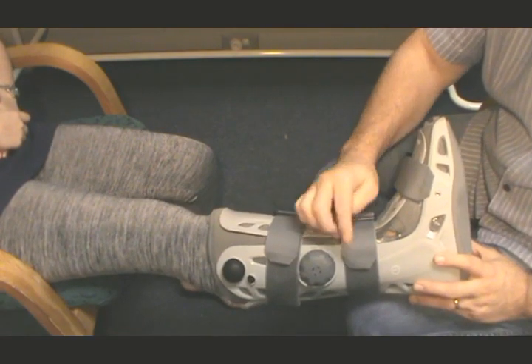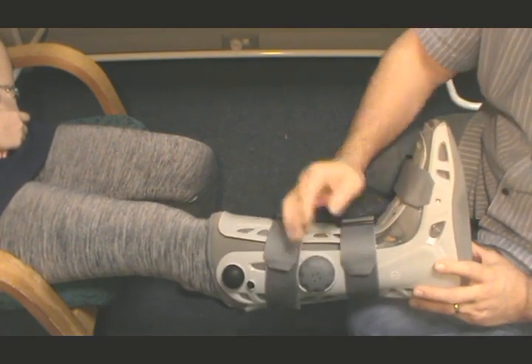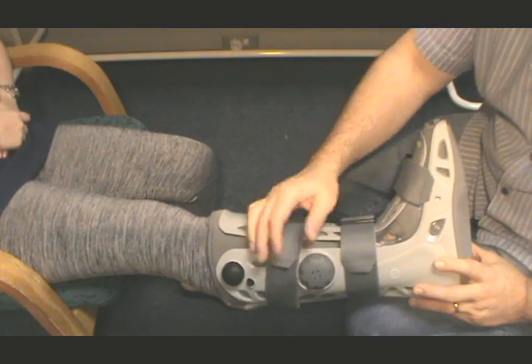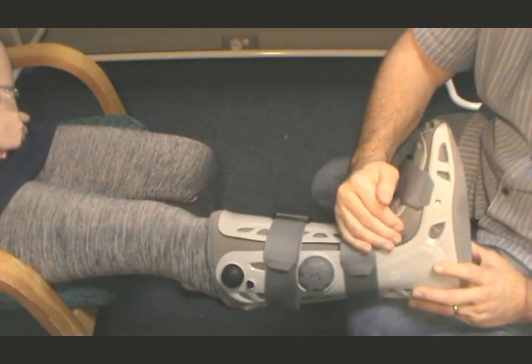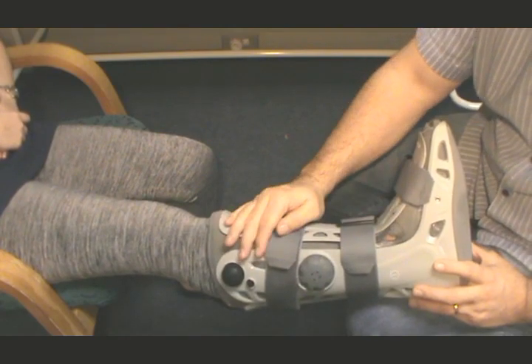I'm going to ask Amy now, can you feel the bag? Yes, she says yes, you can feel it. And that's what you want to do. You want to know whether the bag is touching your leg. When you start feeling the pressure, you stop pumping.